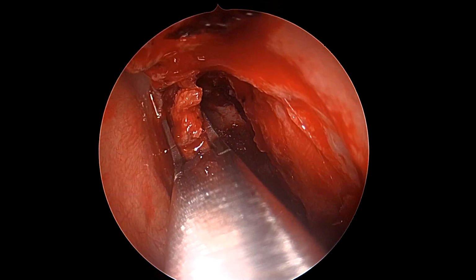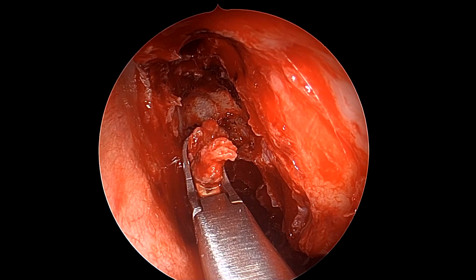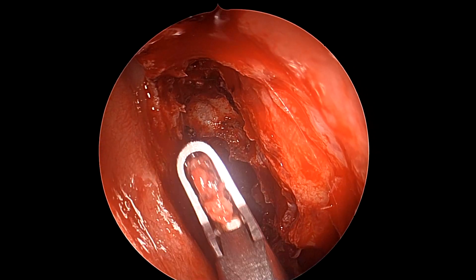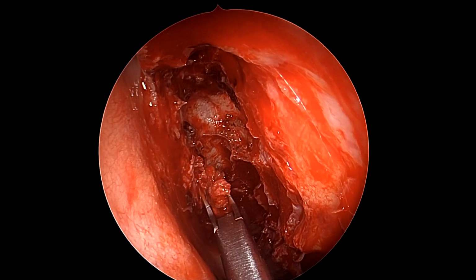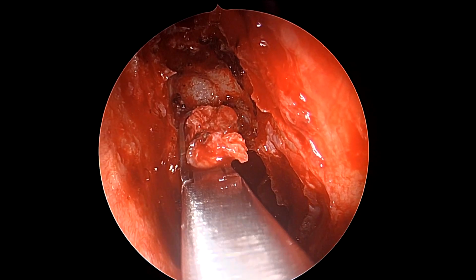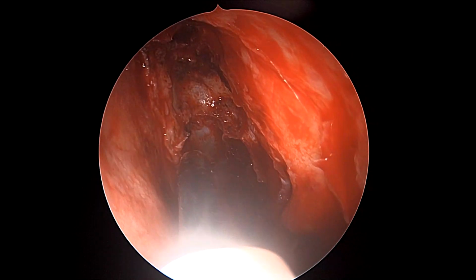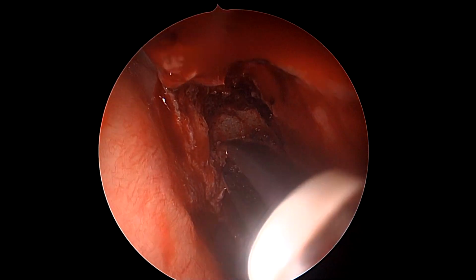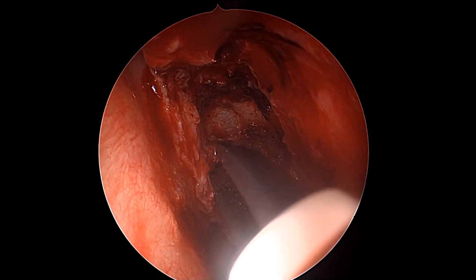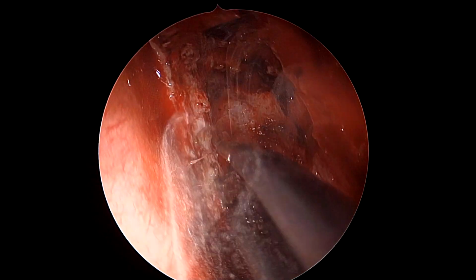So the concepts of any skull-based leak, whether it is from sphenoid, ethmoid, or cribriform plate, remain the same. It is isolating the defect. It is coagulating it using a coagulation device or a bipolar forceps. It is reasonably ablating the mucosa around it, making the bone flush if it is already not so, and then using an appropriate graft for the kind of defect that we see. And once we have seen that, we use the bipolars to coagulate the defect region as well as the mucosa around it.